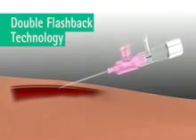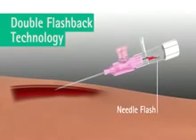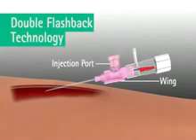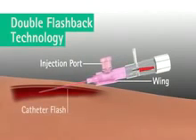Upon insertion, the first flashback of blood, needle flash, is visible in the clear flashback chamber, confirming the needle tip is in the vein. Using the injection port on the catheter hub or using a wing, the catheter is advanced forward off the needle into the vein.